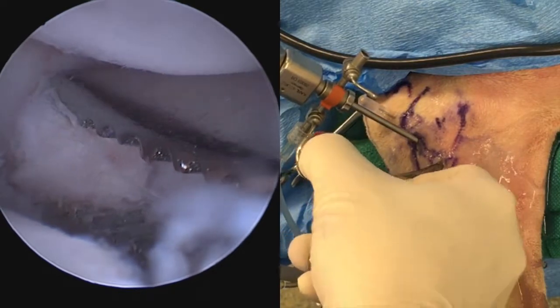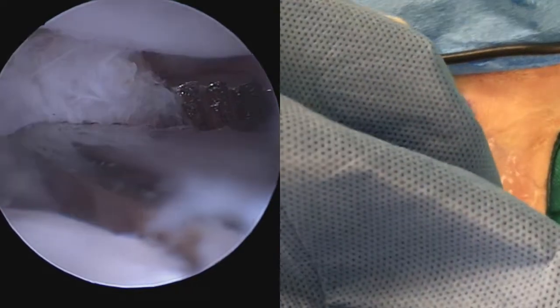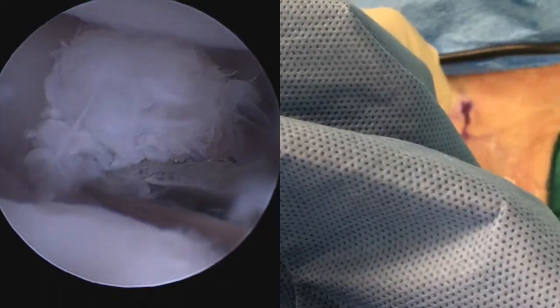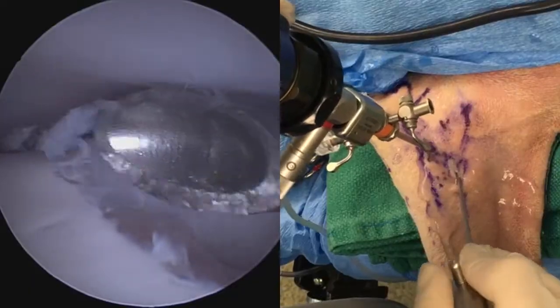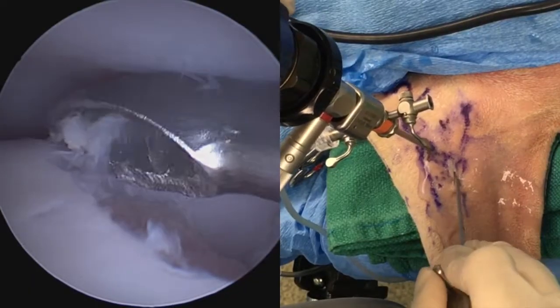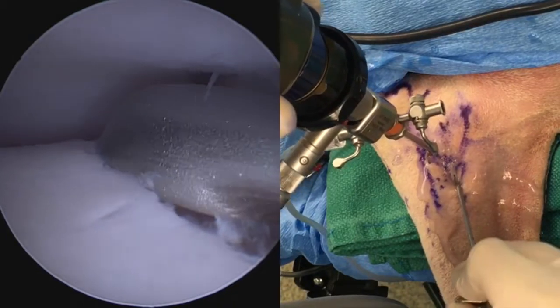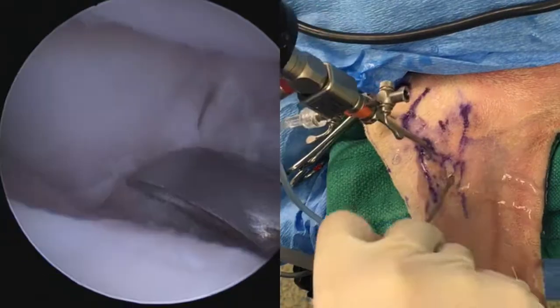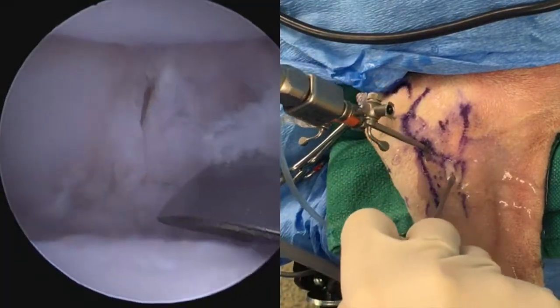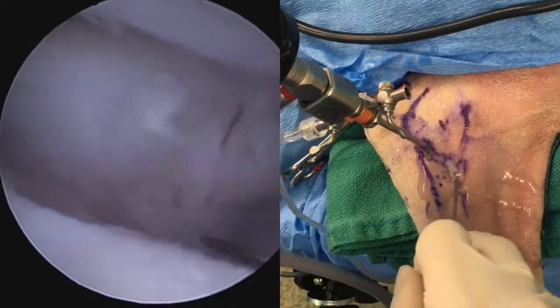In this case, removal is being done with just a pair of straight mosquito hemostats, but grasping forceps are also very useful. The margins of the remaining cartilage are then cleaned up with a curette or a shaver until we get a nice smooth surface of the ostectomized region.